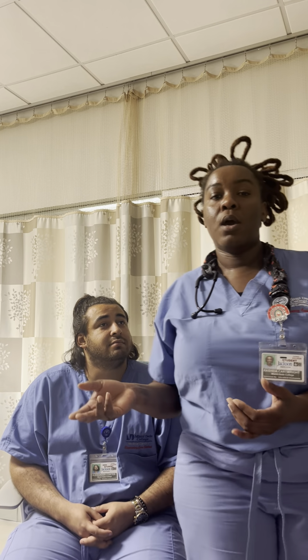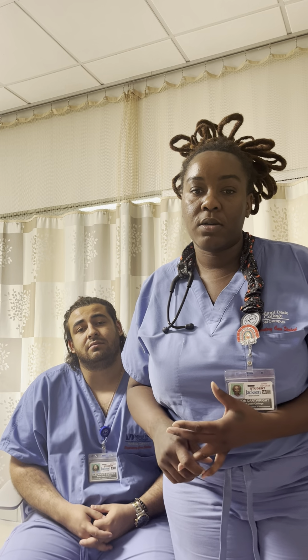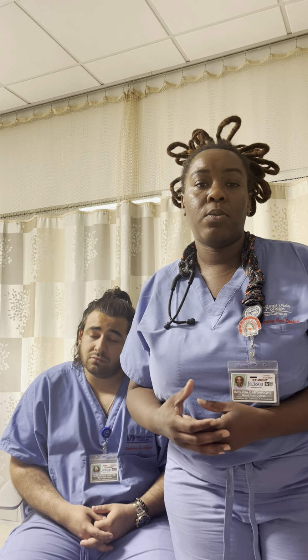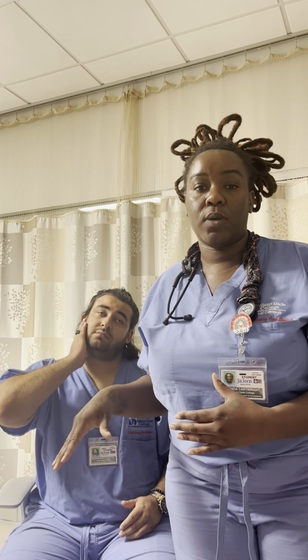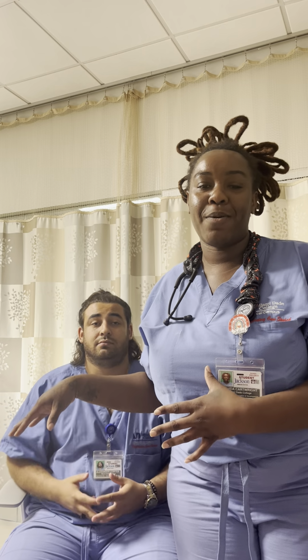Contraindications would be patients that are heavily sedated or comatose, patients that are young kids who are unable to perform it, and patients that have some mentally altered status. Those types of people won't be able to perform this because this is completely patient dependent. Okay, I'm saying this, not surgery, this therapy.